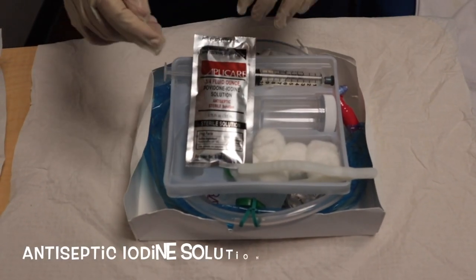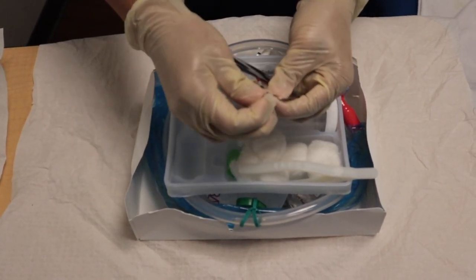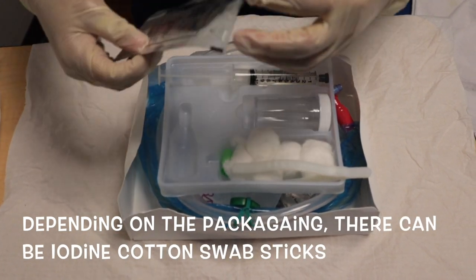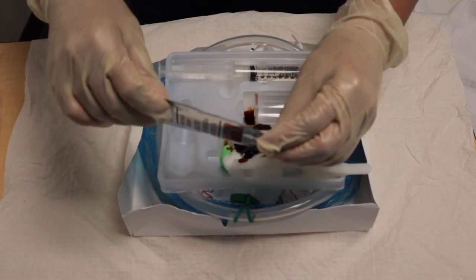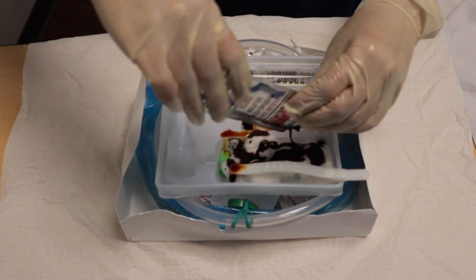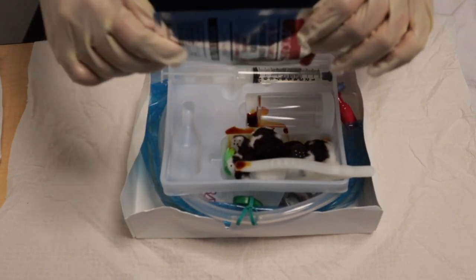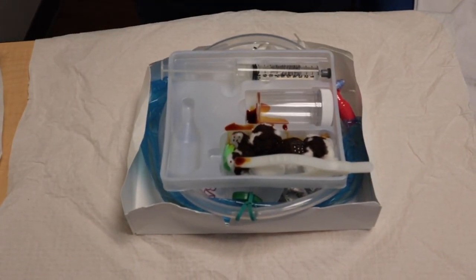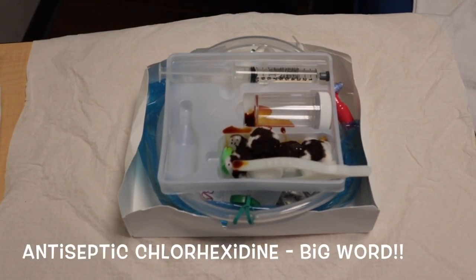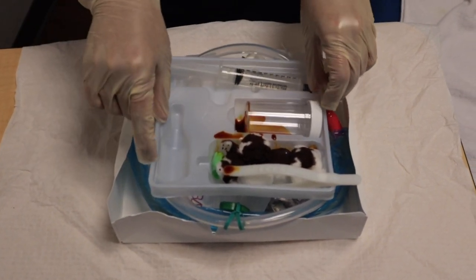Inside the kit, there is an antiseptic iodine solution packaging. Tear it open. Depending on different packaging, there can be iodine cotton swab sticks. I personally like those better because it's not so messy when I take them out. Ensure the patient is not allergic to iodine. If they are, there is antiseptic chlorhexidine as an alternative. Don't worry about the syringe right now. You will need it later.